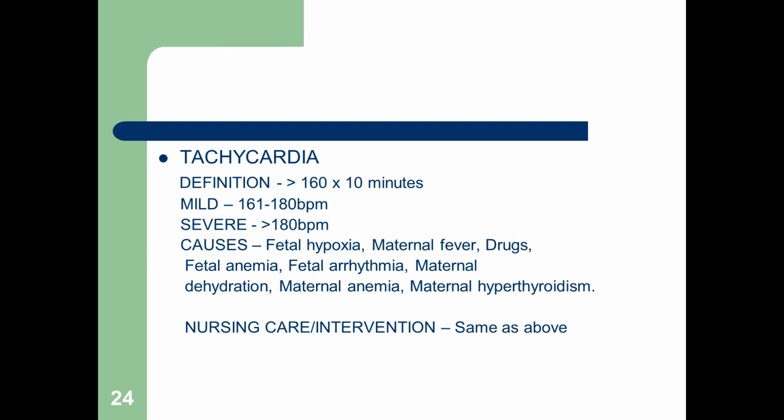So if you saw an elevated fetal heart rate for no reason, contractions are going good, perhaps the mother has a fever, or maybe there's history of drug use or something along those lines. And so think in terms of when you see something, if the baby is doing something different on the monitor, like the heart rate's going up or going down, check your mom as well, okay?